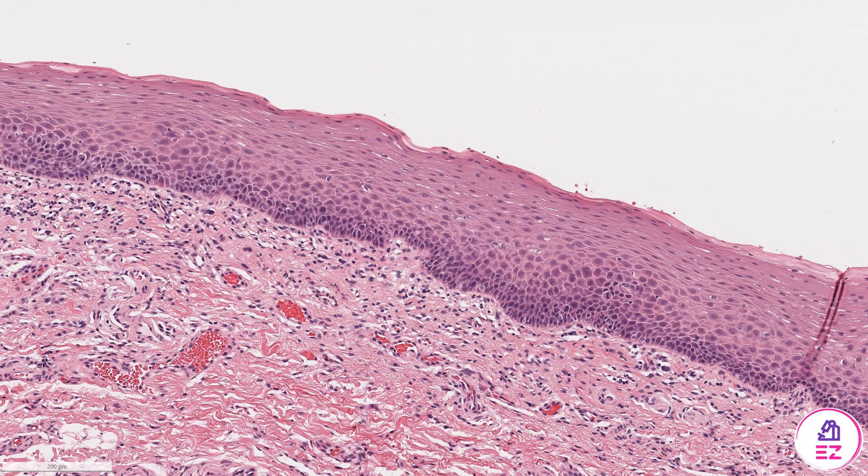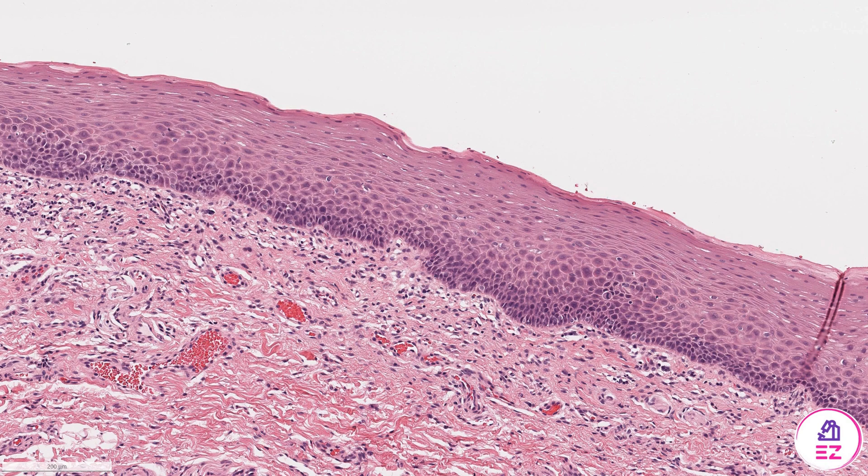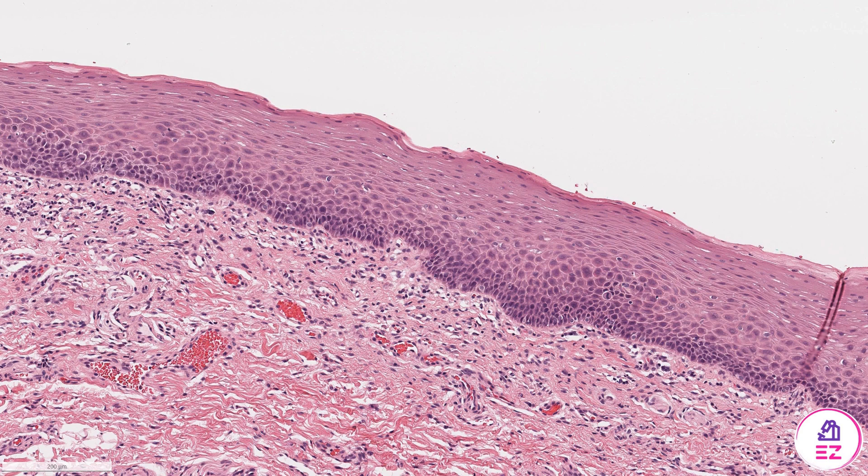Hello and welcome to Path Made Easy. Today's case is an example of oral lichen planus affecting the buccal mucosa.